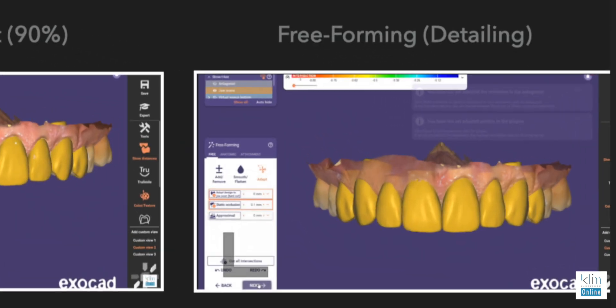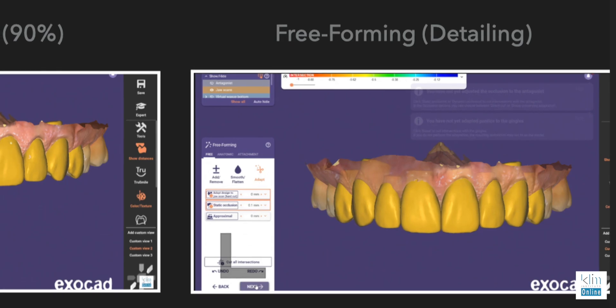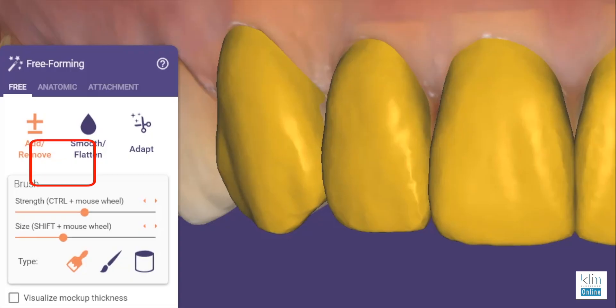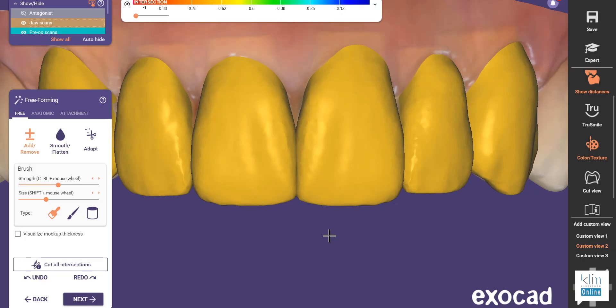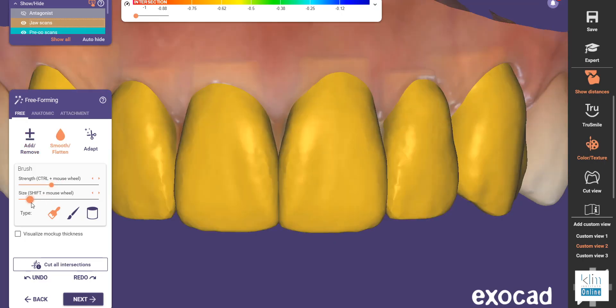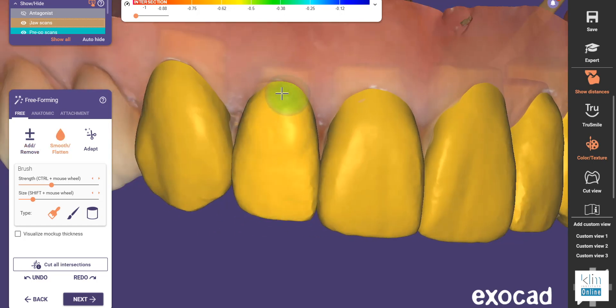When I go over to freeforming, I don't have a lot left to do. I'm mainly detailing in this screen, and that's where I use my add, subtraction, and smooth tool — what we call the form tool in CEREC. We have the same features: we have strength and paintbrush size. In Exocad, I use a strength feature of around 35% to 50%, but I click when I'm adding and when I'm smoothing.